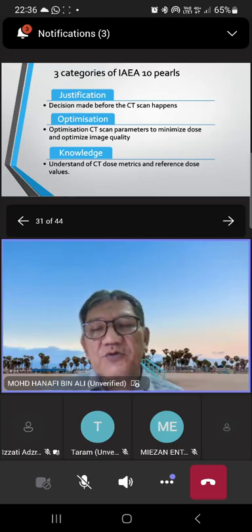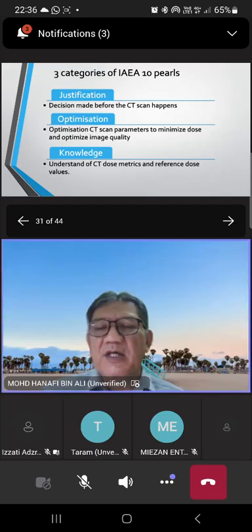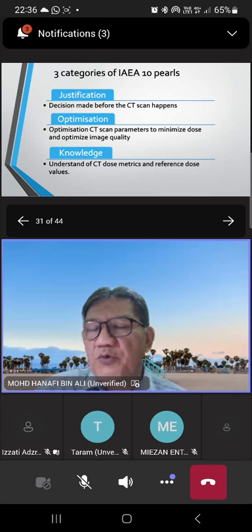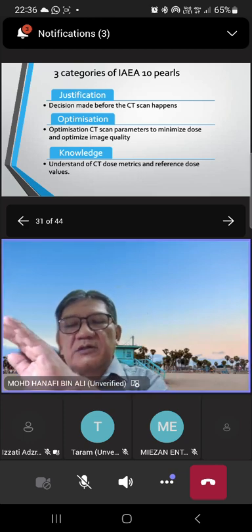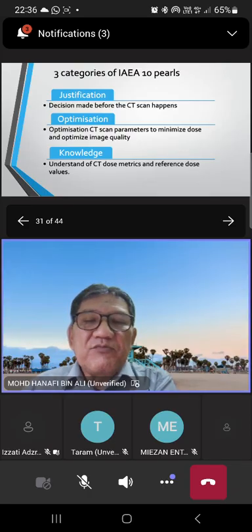Tapi kalau katakan tadi radioisotop, more dangerous because number one, we cannot see that. We cannot feel that. Cuma kita gunakan detector, X-ray detector and reader there. Then totally the radioisotope we cannot control unless we close it with the appropriate proper lid, for example.